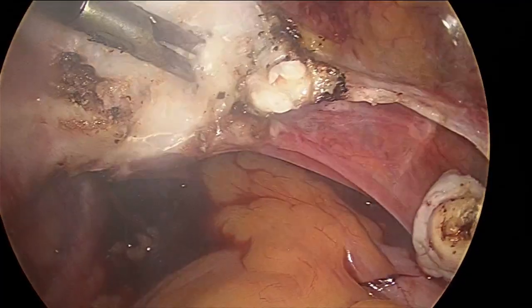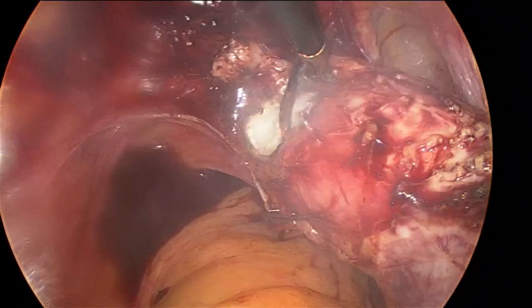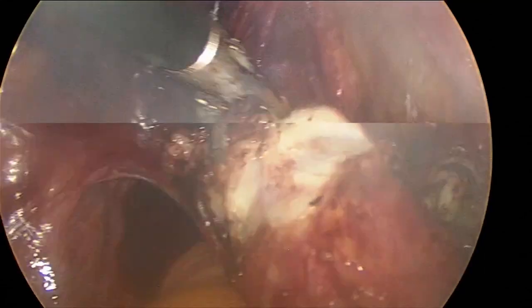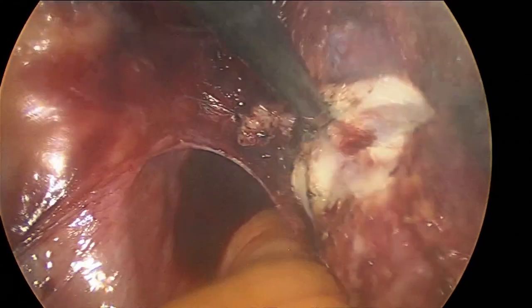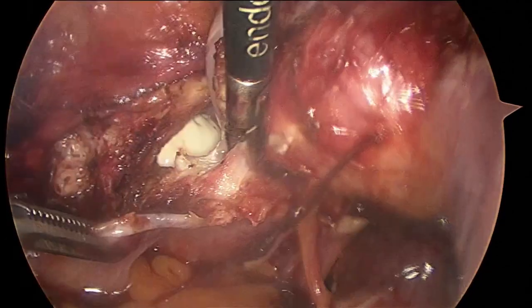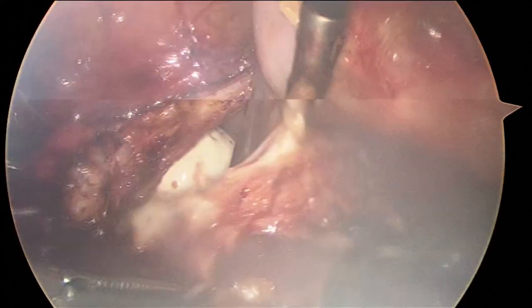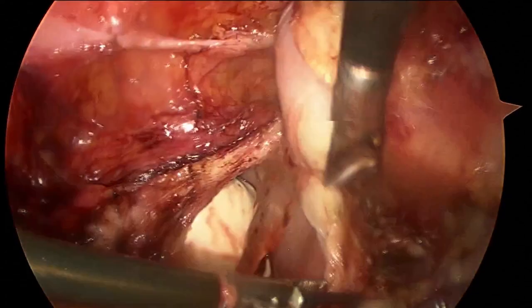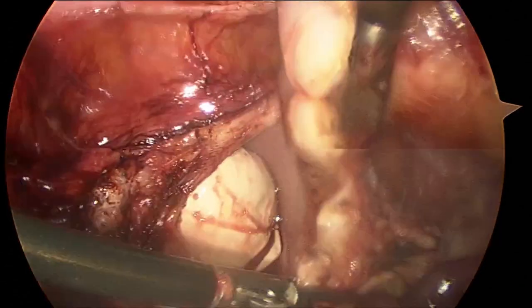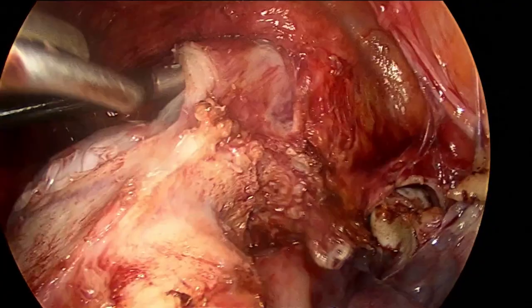After that, resection was carried out from the left side and the anterior vaginal wall was dissected. First, the cervicovaginal fascia was dissected, and then the vaginal wall was cut off. The vault was opened anteriorly and proceeded circumferentially to completely detach the uterus from the vagina, remaining near the cervix to avoid unnecessary shortening of the vaginal length. The posterior dissection was completed for the vaginal wall and the remaining right side dissection was carried out.